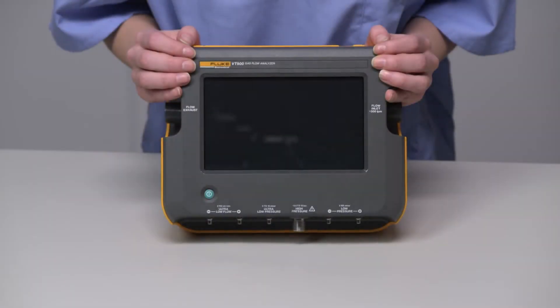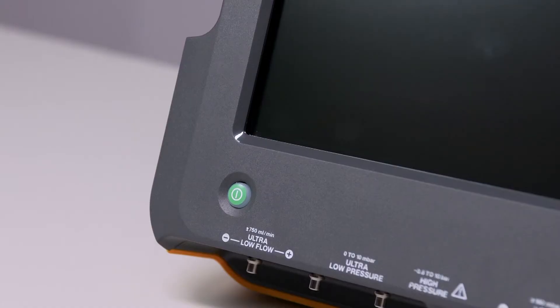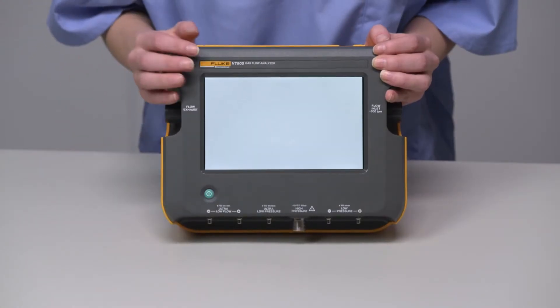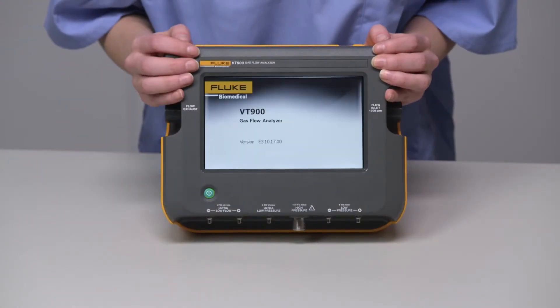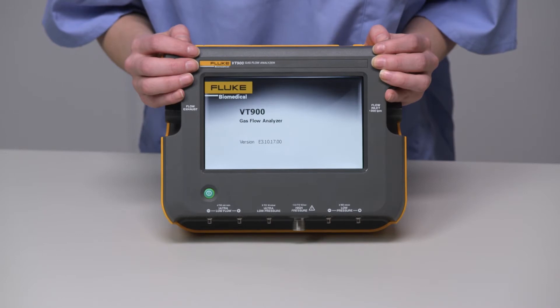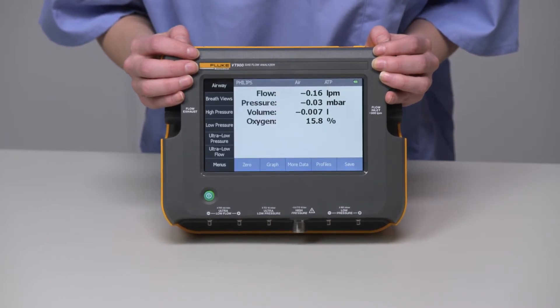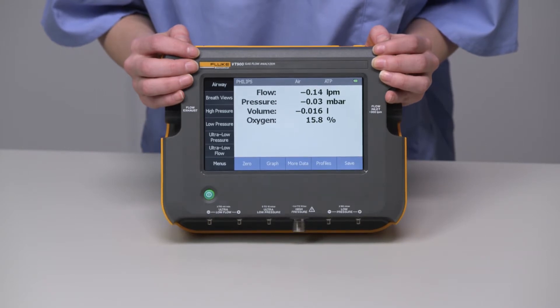To begin, turn on the unit by pressing the power button. The device will show an initial screen during which it is performing a self-test. When it is ready for use, it populates to the default screen, which is the airway channel.